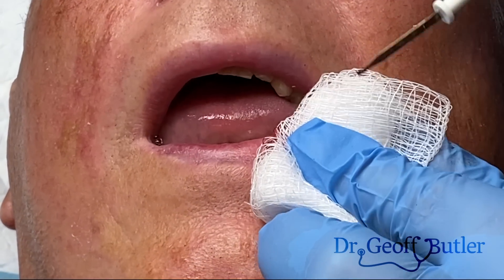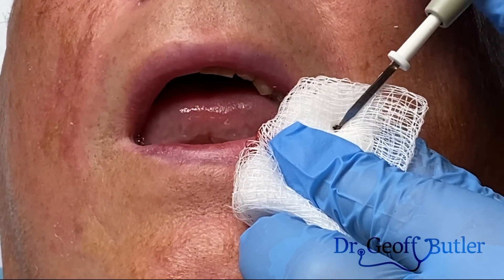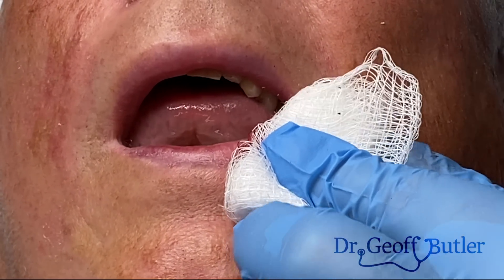With hyfrecators like this, you have to always be dabbing — because if you fix it, it'll stick to the tissue, and then when you pick it up, it'll pull that scab off.